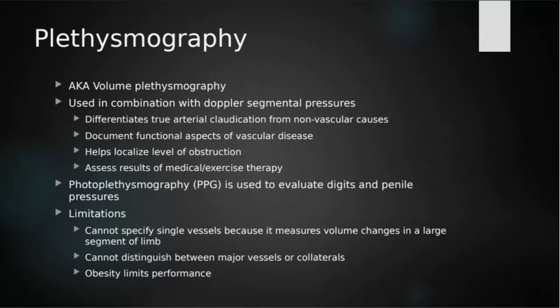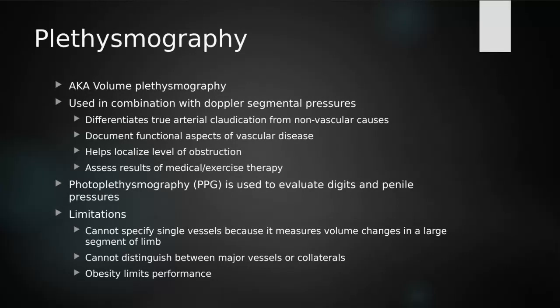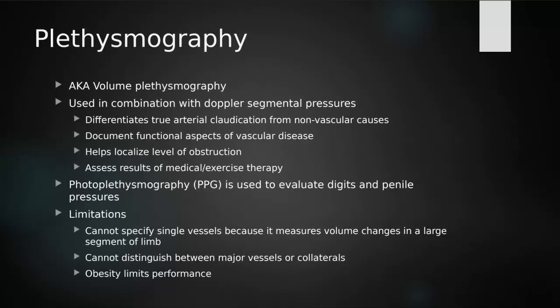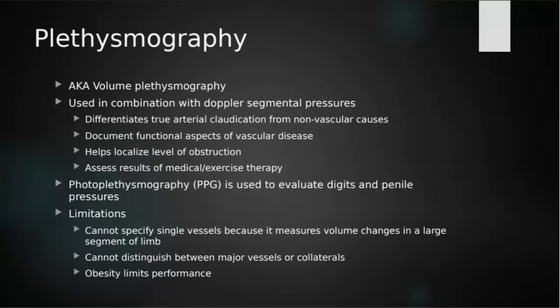So if our patient is undergoing arterial treatments for whatever condition, we can continue to do plethysmography and Doppler segmental pressures to see if that therapy is actually helping them. Now, PPG is used on very small tissues and vessels. So we use PPG to evaluate the fingertips, the toes, and penile pressures, which we'll talk about in a second.